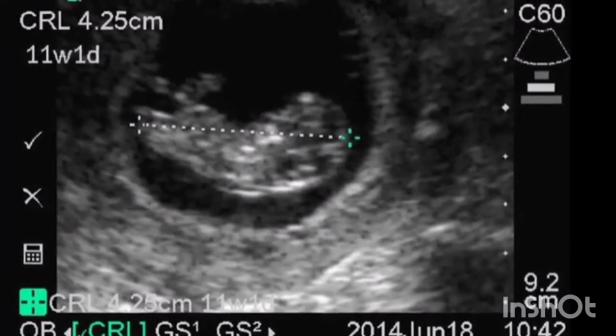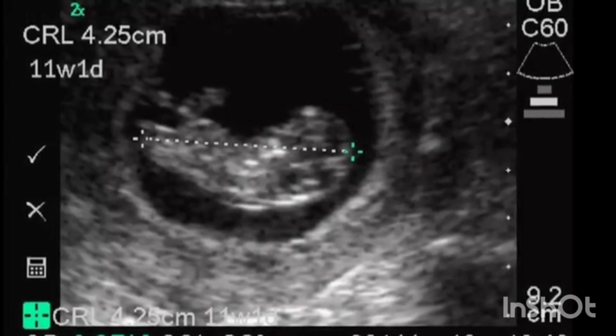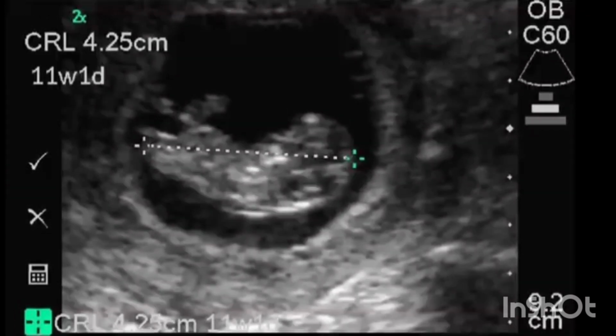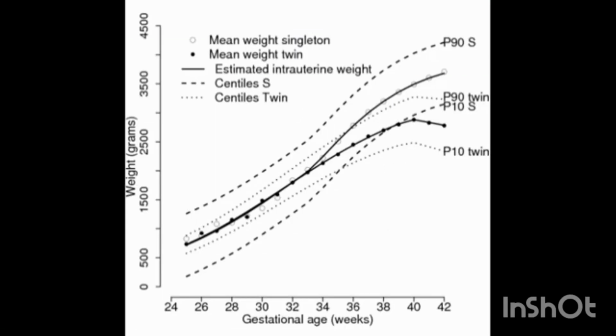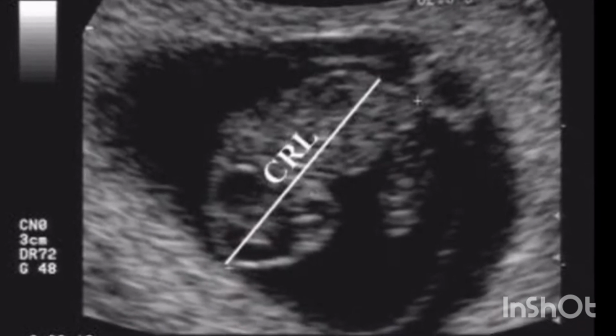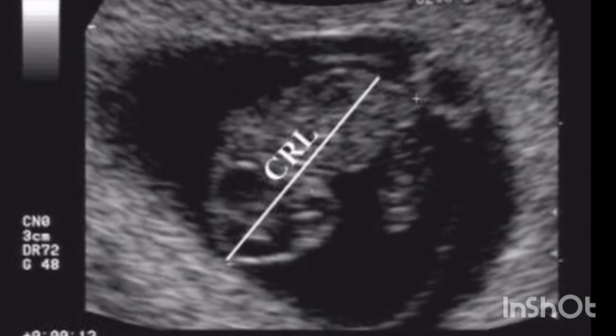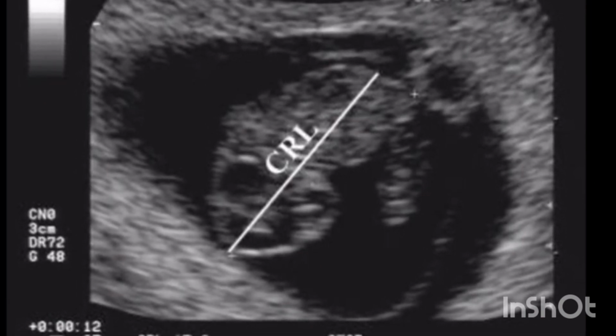Measurement of the crown rump length can easily be done at the time of the first trimester scan, 11 to 14 weeks of gestation. Later in pregnancy, correction of gestational age should be avoided, since growth curves in multiple pregnancies differ from those in singleton pregnancies beyond the second trimester. Crown rump length. Between 6 and 12 weeks gestational age, the measurement of the crown rump length of the embryo is most accurate for dating.